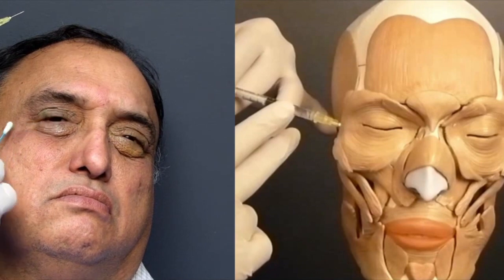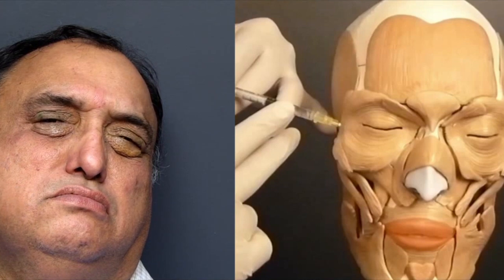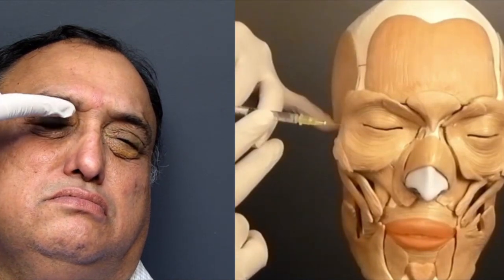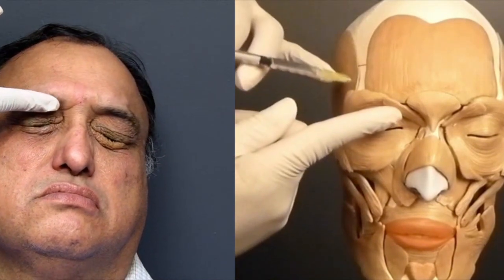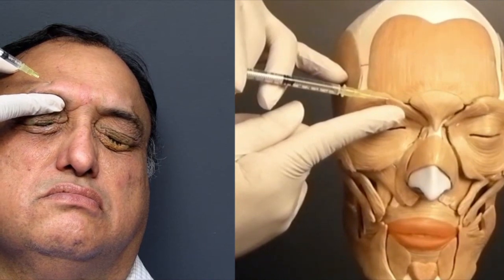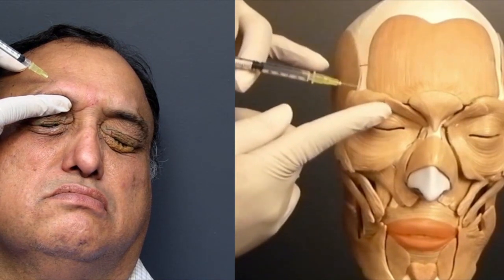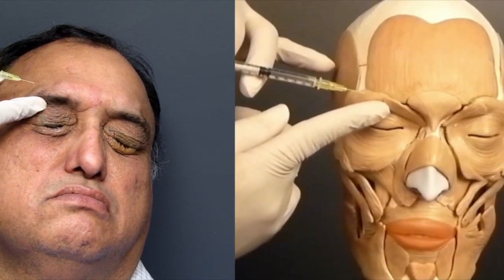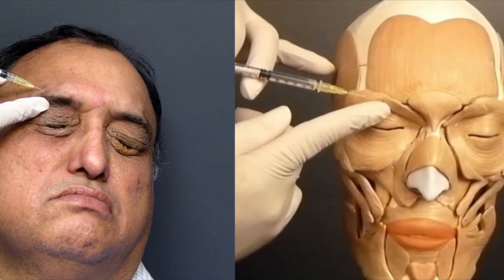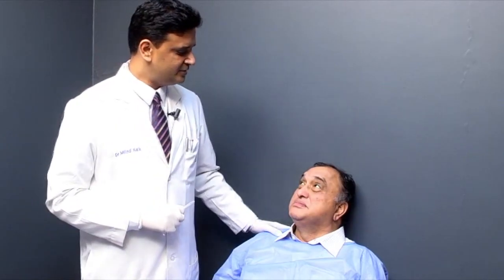We have finished the mid-pupillary lower eyelid, the lateral canthal lower eyelid, and the fifth point which is one centimeter lateral to the lateral canthus. Now for the brow injections, as described earlier, place a finger on the orbital rim and give the first injection at the junction of the medial and central third of the brow, and the second at the junction of the central and lateral third, about 8 to 10 millimeters above the hair-bearing part of the brow. That completes the injection procedure.